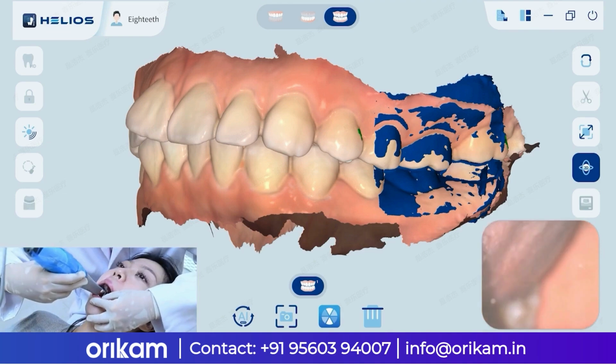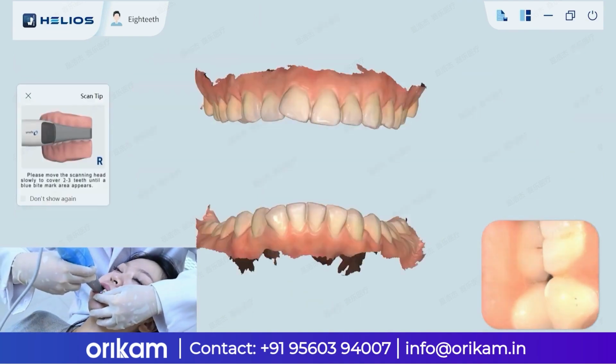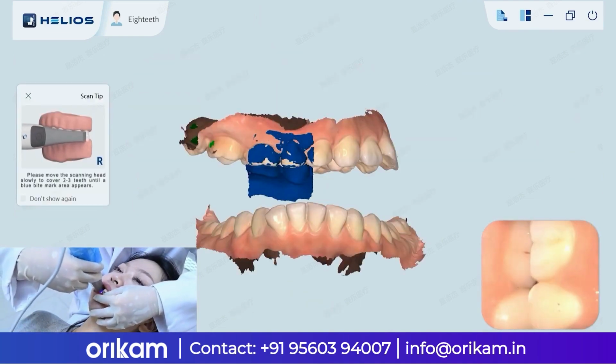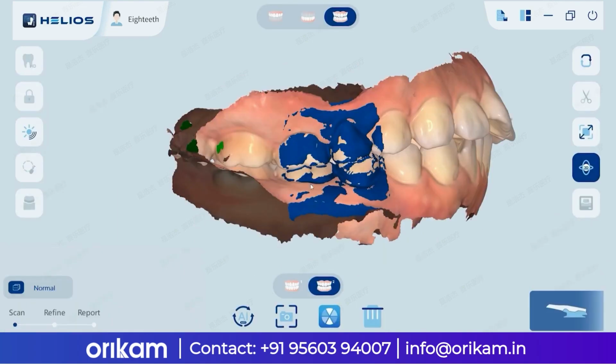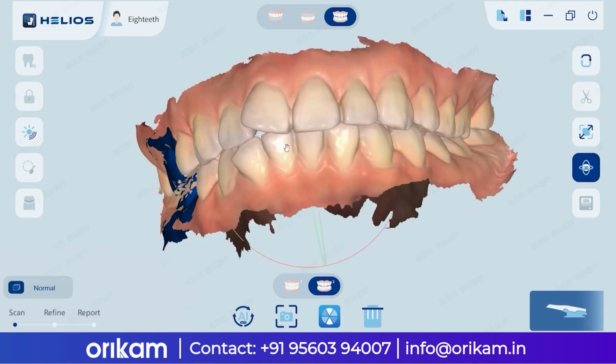Repeat the same procedure on the patient's right occlusal surface to ensure a comprehensive occlusal scan. Upon completion, review the scanned occlusal surfaces.